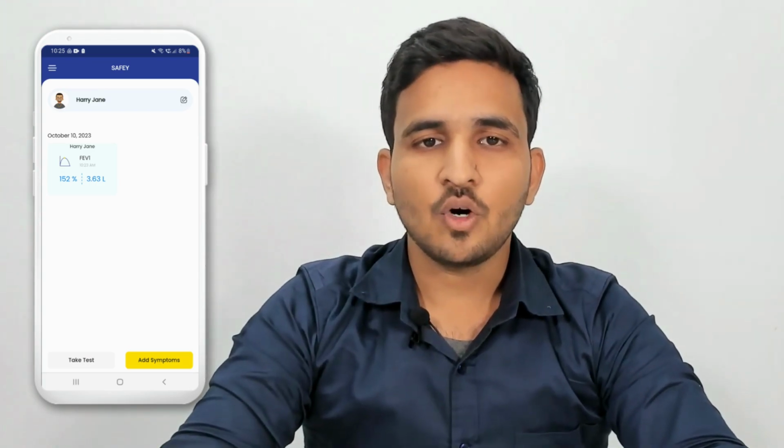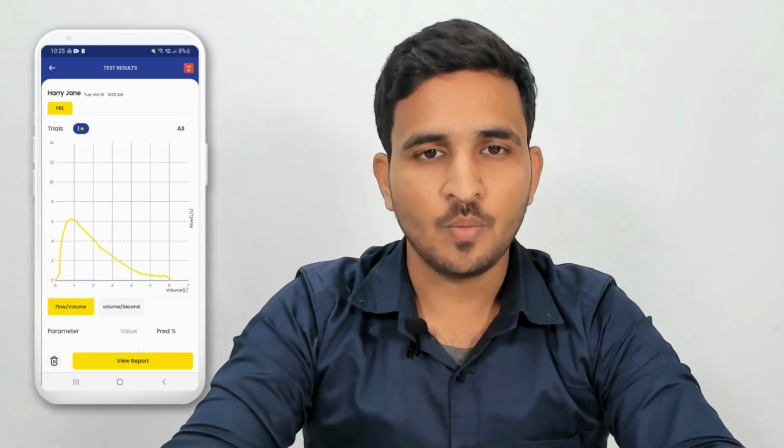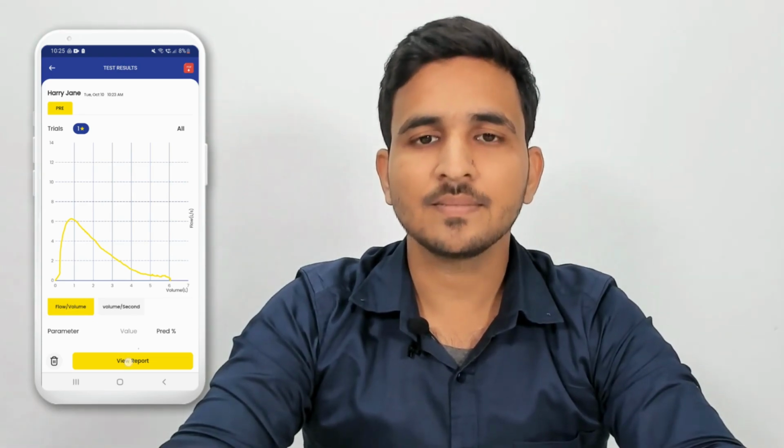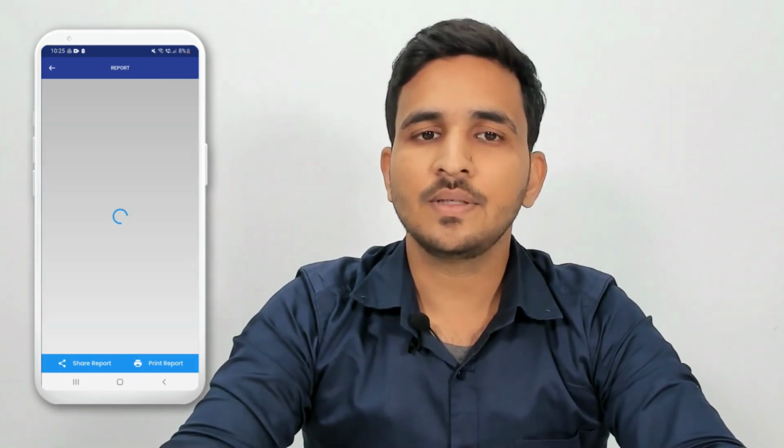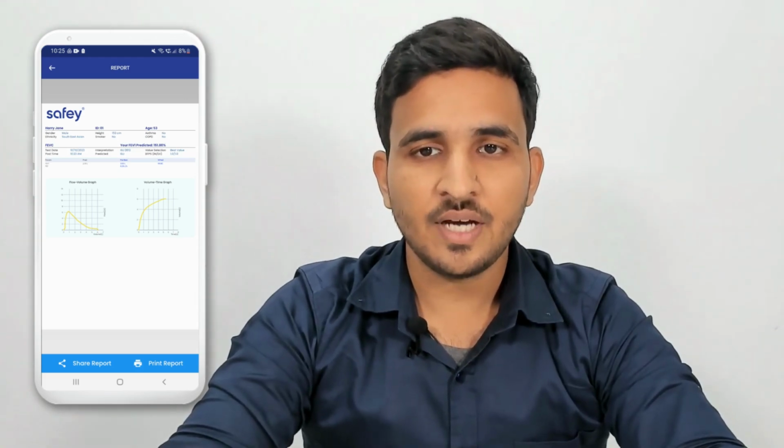This is the history of last test taken by the patient, and you can print or share the customized report by selecting the View Report option. That's it. You have successfully completed the respiratory test using the Safey application.